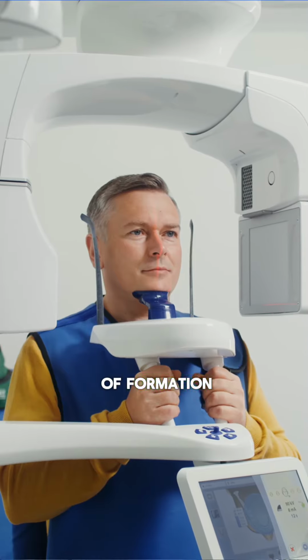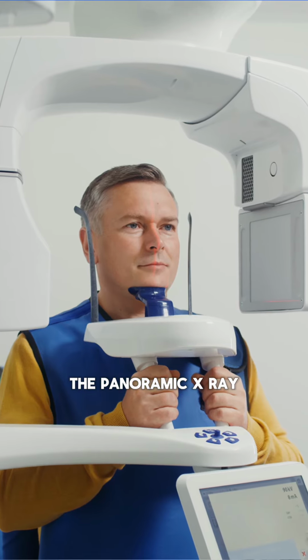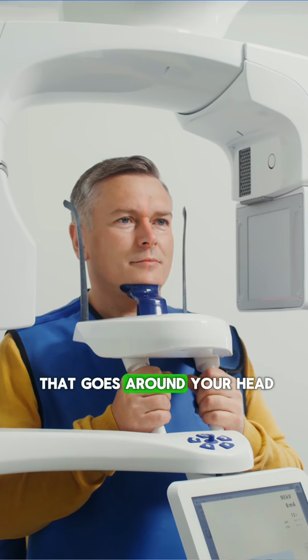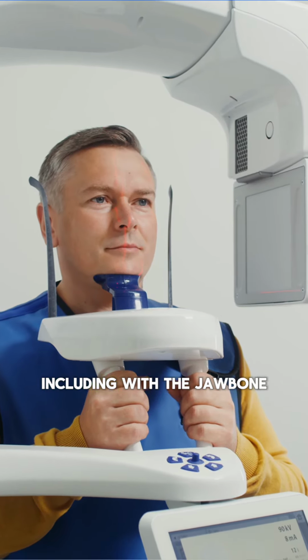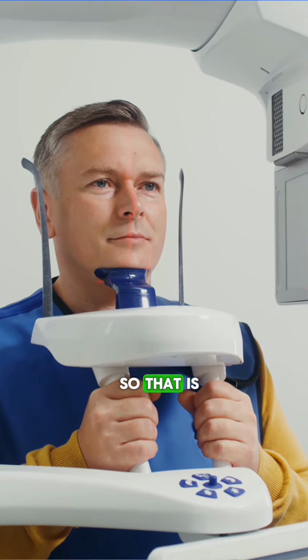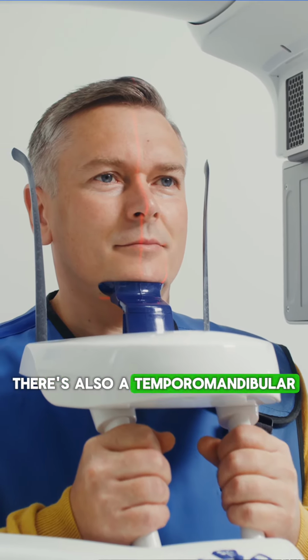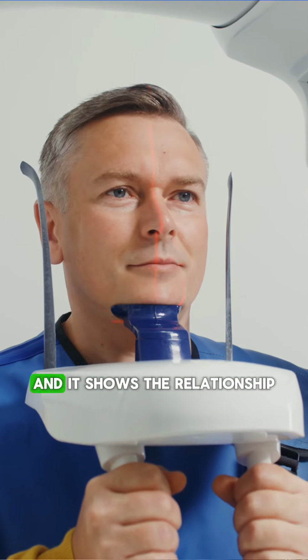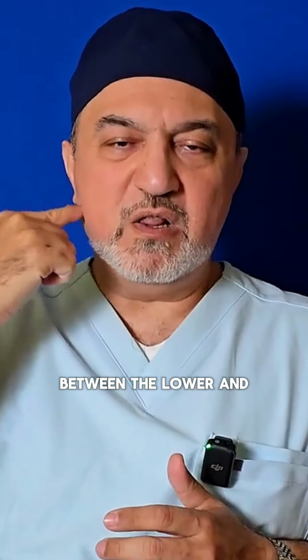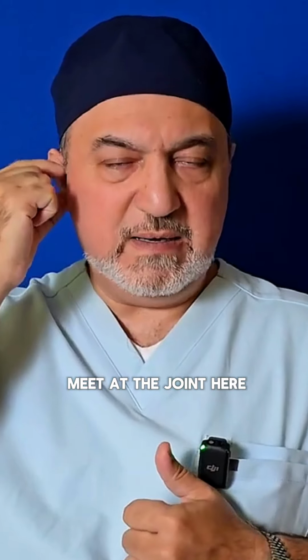of formation. Now the surgeons like to use panoramic x-ray. Panoramic x-ray is the x-ray that goes around your head, and you can see most of the teeth that the patient has, including with the jawbone. So that is the x-ray for that. There's also a temporomandibular joint x-ray, the x-ray that shows your side, and it shows the relationship between the lower and the upper jaw and how do they meet at the joint here.